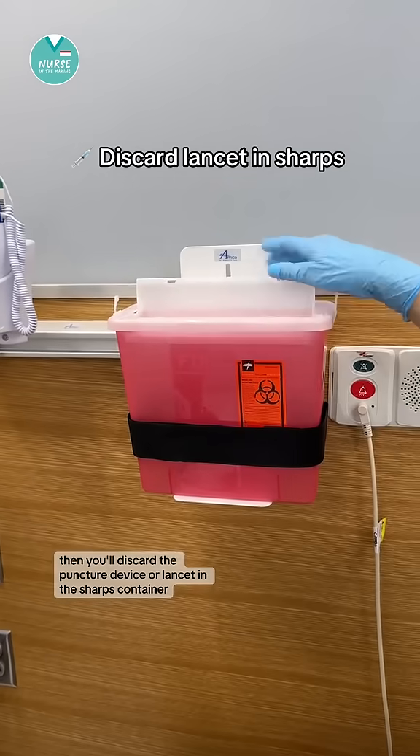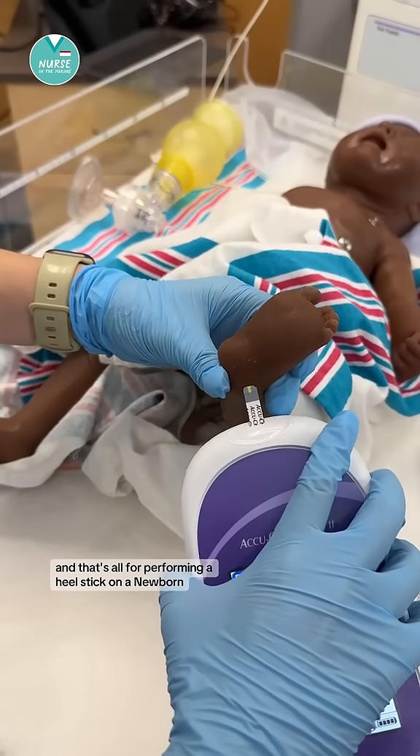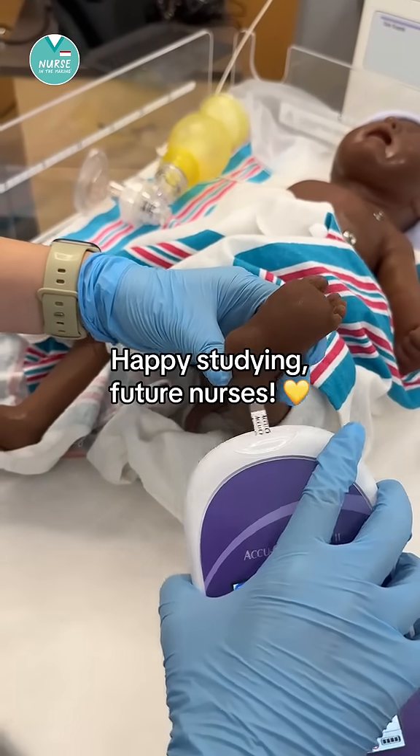Then you'll discard the puncture device or lancet in the sharps container. And that's all for performing a heel stick on a newborn. Happy studying, future nurses!